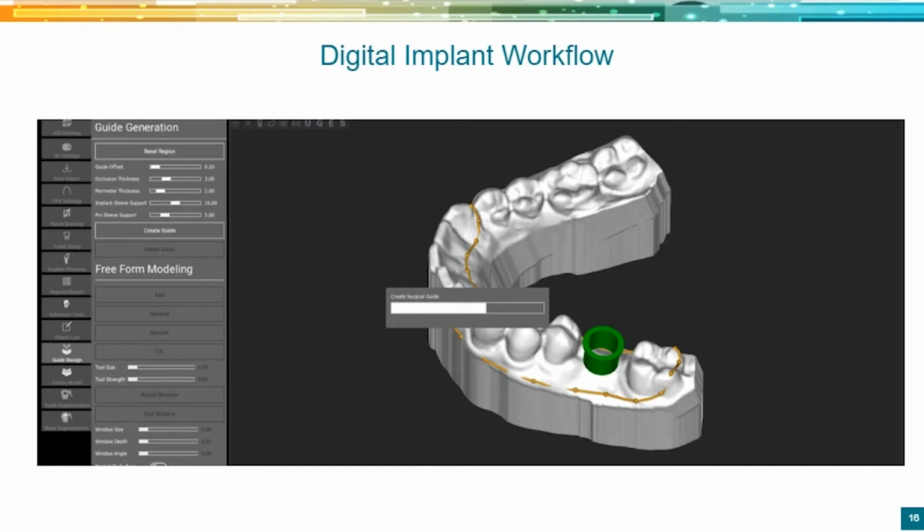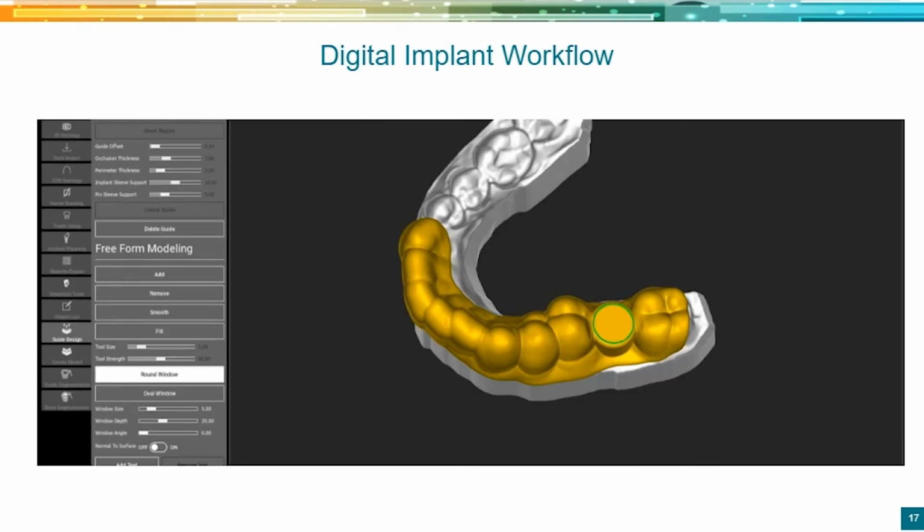Okay, I don't do a lot of punch flapless surgery. I'm a believer in keeping as much attached tissue as possible, so I still think we should be doing full thickness flaps for a lot of these. But if you are, make sure you have a little bit extra guide there to kind of pin your flap down for you, so you don't need an extra pair of hands. It's essentially going to make a suck down where you told it to.